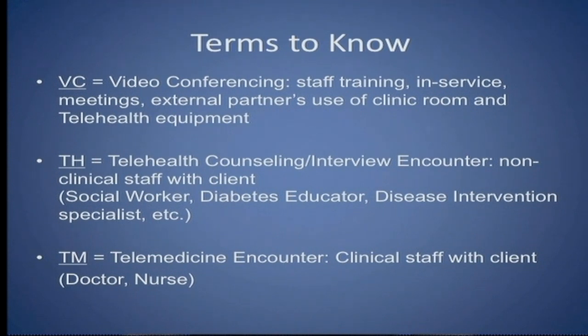This is used for non-clinical encounters with the client, such as social work visits, a diabetes educator visit, or disease intervention specialist visits. And finally, TM, which means telemedicine. This is a physician-patient or medical care provider encounter. This is with clinical staff and the client.